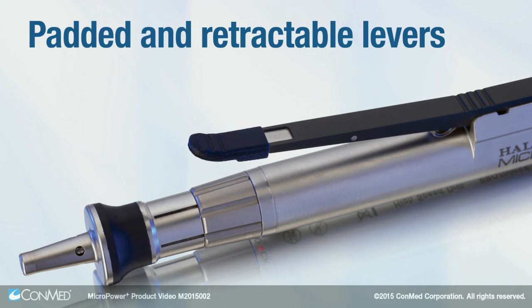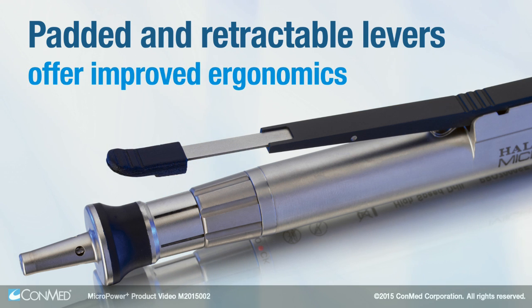Padded and retractable levers on the drills and reciprocating saw offer improved ergonomics.